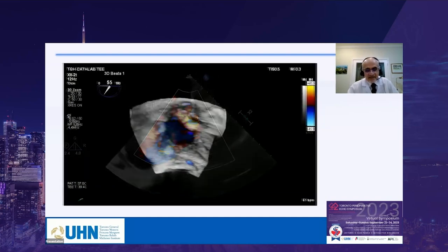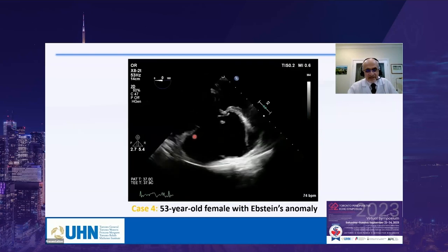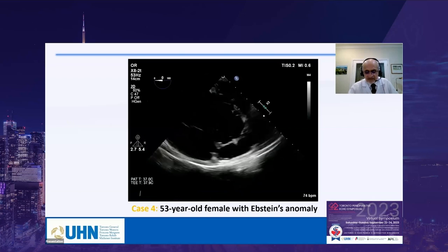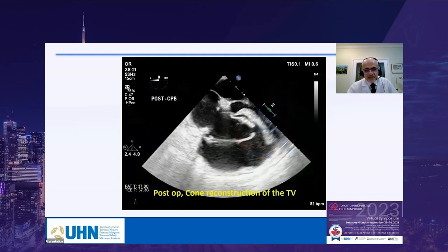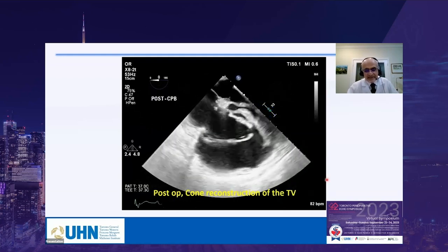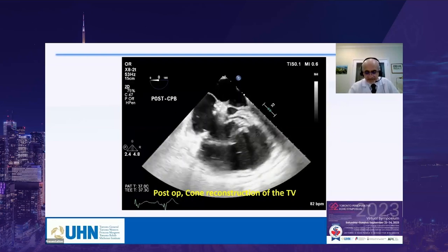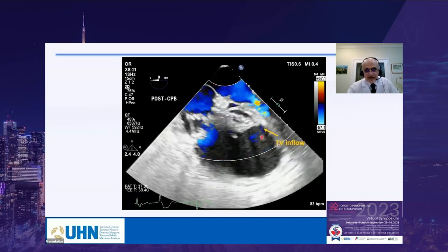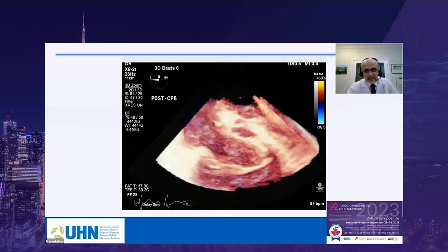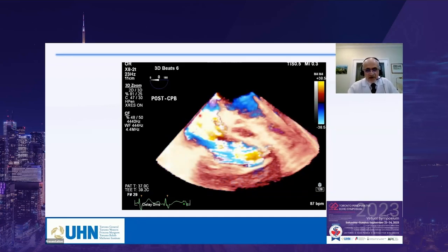This is another case of Ebstein's anomaly. You can see the sail-like anterior leaflet and severe TR. A cone repair was performed at our center by Dr. Honjo — the leaflets are reconstructed into a cone shape. The opening of the cone faces the RV, representing TV inflow. On color Doppler, flow from the RA enters the inside of the cone and exits from the mouth of the cone.